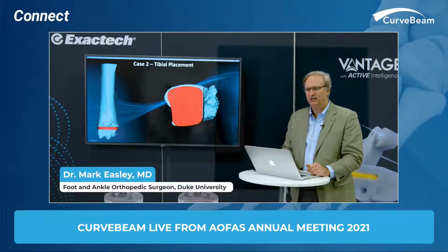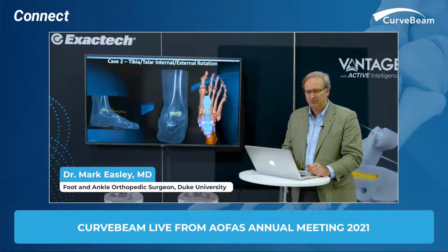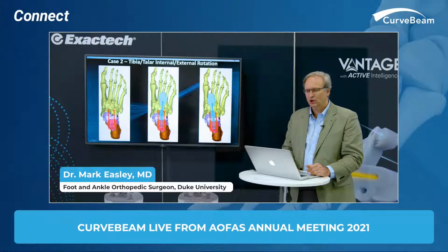I know where the medial malleolus is. I'm not going to let this externally rotate. I'm going to get the best possible coverage for this. You can see here I'm planning this out, and even here's the instrumentation. On the weight-bearing CT, I'll know exactly where this sits. So to me, this really makes it so much easier because I'm planning it all in advance.